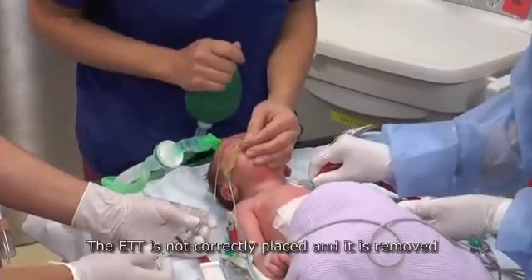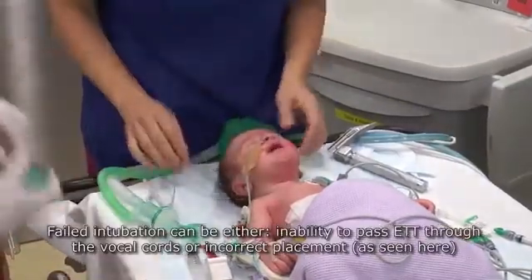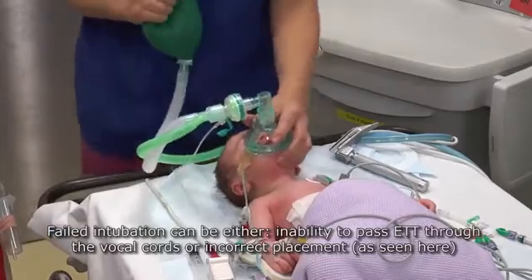If the endotracheal tube is not correctly placed, it is removed. Failed intubation can be either an inability to pass the endotracheal tube through the vocal cords, or incorrect placement. Early recognition is critical.